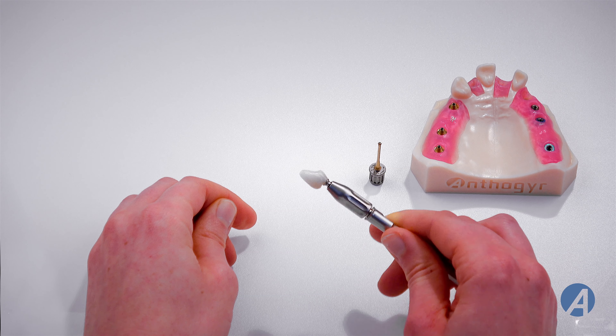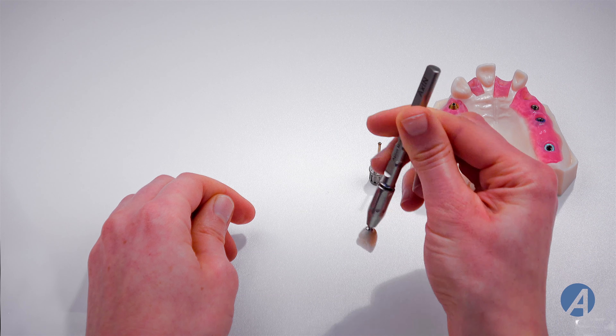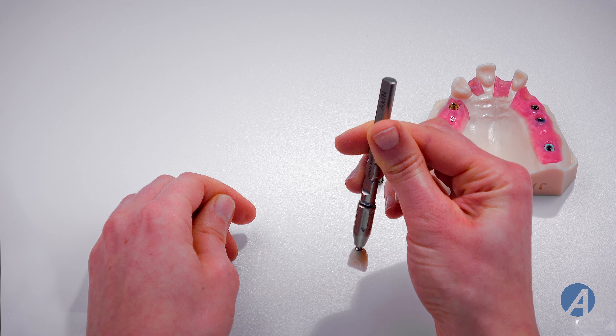Place the crown on the assembly and turn to indexation — you will hear a click. Notice that the crown is now retained in the base.